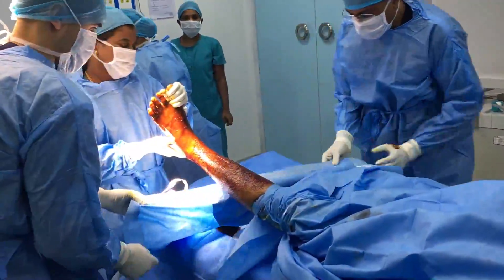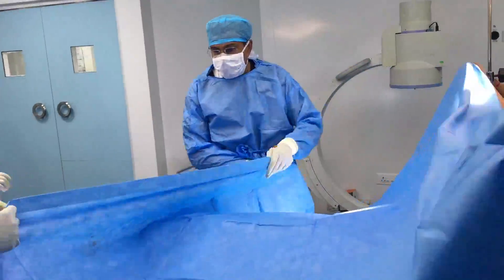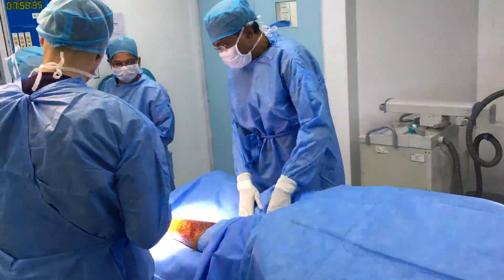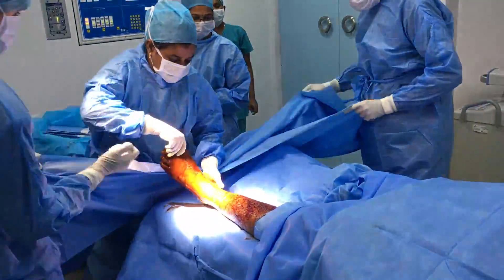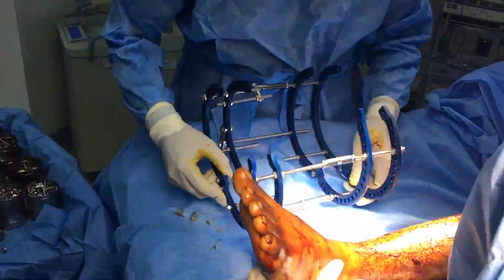A standard set of knee drapes is used — these are disposable drapes that are routinely used. The foot including the interdigital area is also prepared.